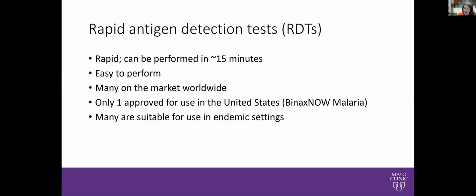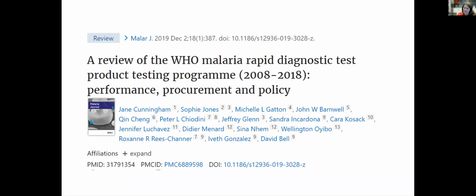So that's why the World Health Organization has put so much emphasis on using these tests, especially because microscopy, as we said, requires a good microscope, a reliable power supply, a skilled worker who is very familiar with malaria, and then a way of keeping that worker competent so that the skills don't drift over time. Those are often things that are a bit of a challenge in a resource limited setting.